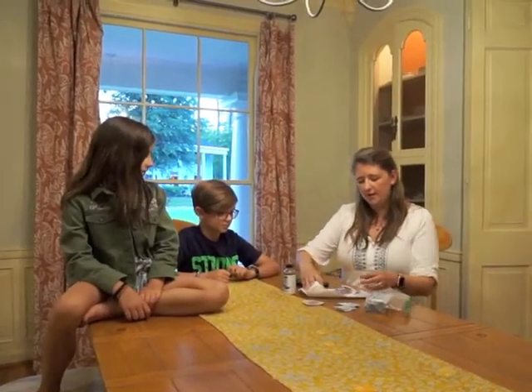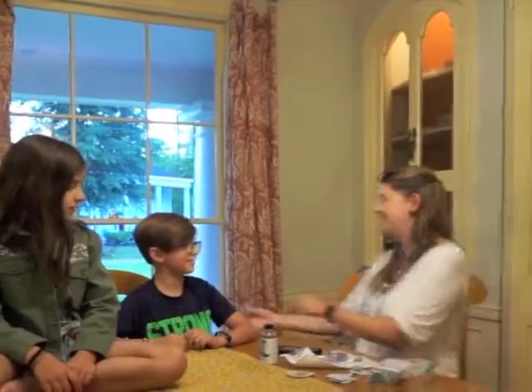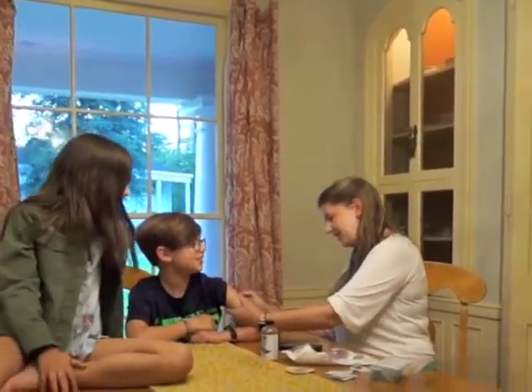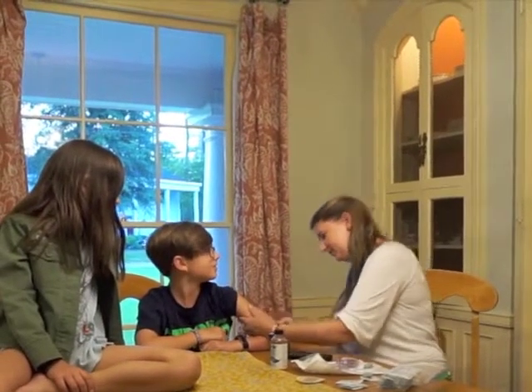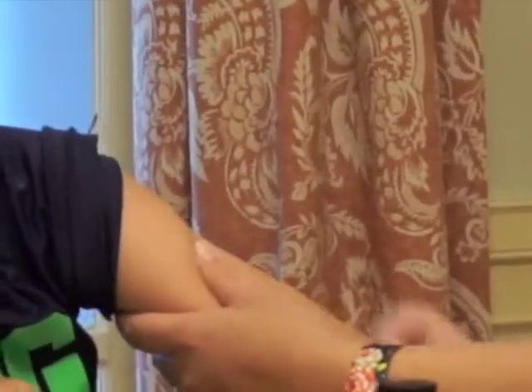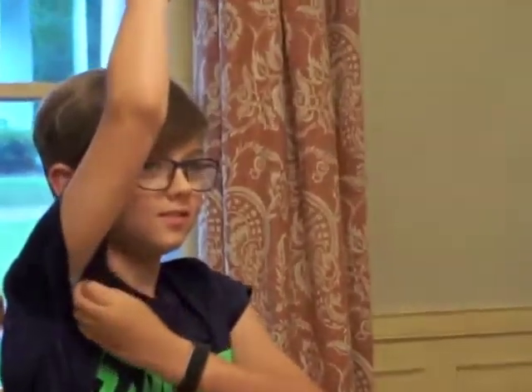The first thing we're going to do is get out his sensor. This is what you apply the sensor with, and it actually is a needle that goes underneath the skin. We're going to clean the area first, then pick out the spot. This arm looks pretty good. We have to make sure we don't put it in a spot that's already been scarred up.